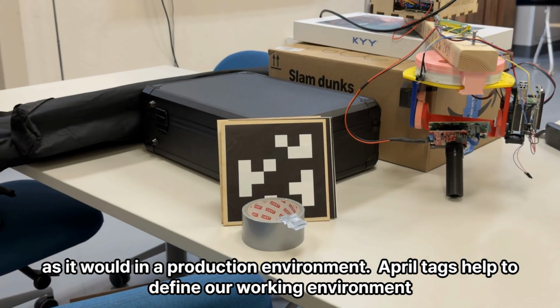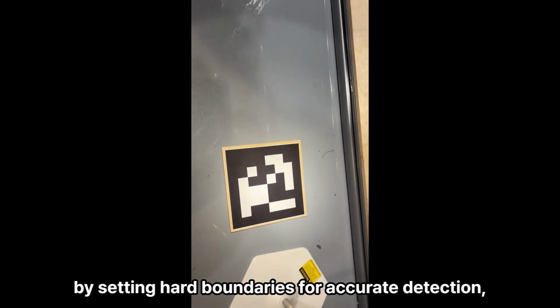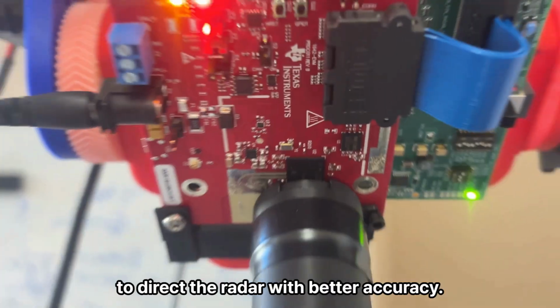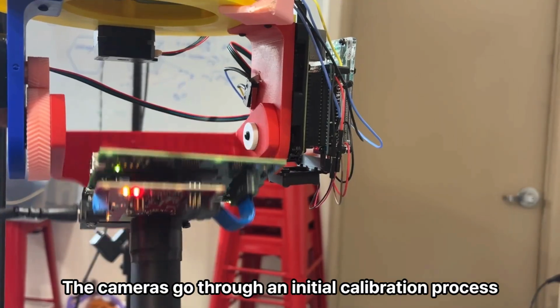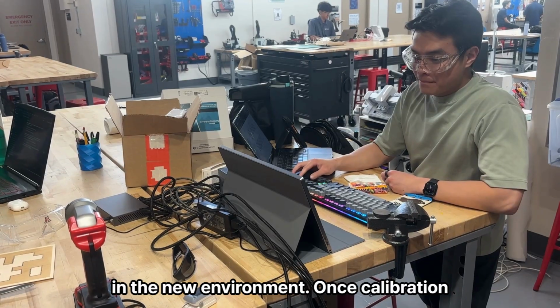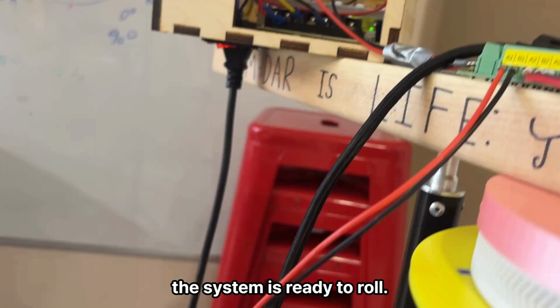Tags help to define our working environment by setting hard boundaries for accurate detection, working with depth, and navigating occlusion. Additionally, working within a defined space allows us to direct the radar with better accuracy. The cameras go through an initial calibration process with the tags upon setup in a new environment. Once calibration is complete and checks have been done for both radar and mount, the system is ready to roll.